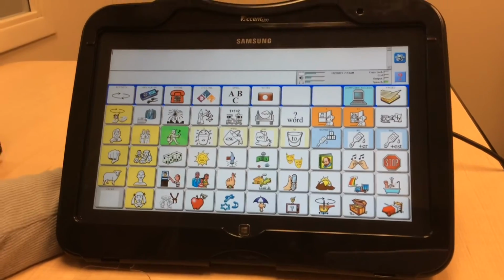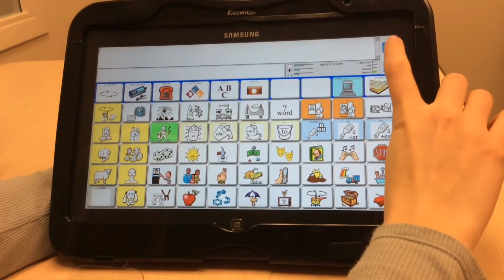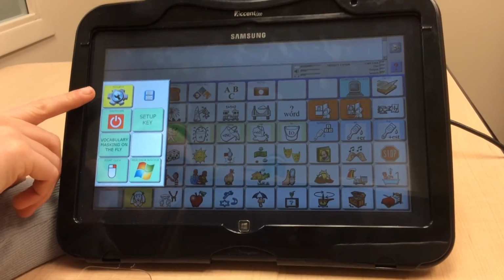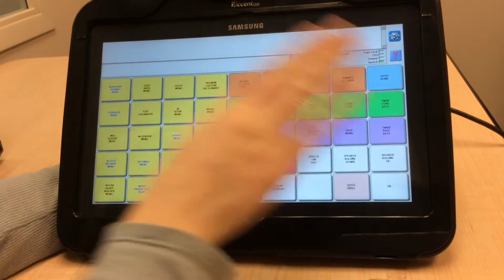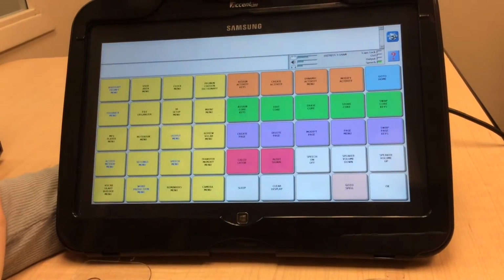Now I'm going to go into our toolbox setting. If you look at the top right-hand corner, there is a tool setting. We're going to click on that. And over here, we're going to select toolbox. All right, so it's kind of divided on the left and right. Emily will be speaking to you about the left side buttons. I'm going to go over the right-hand side.